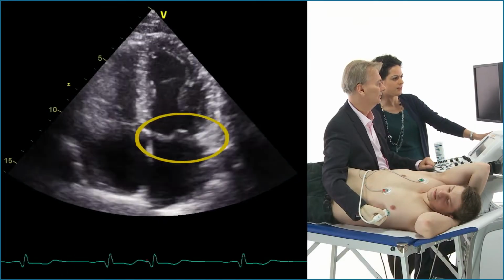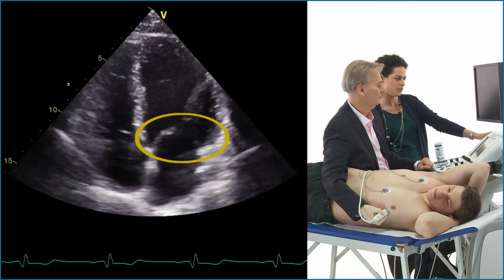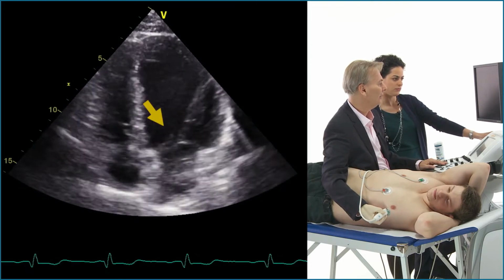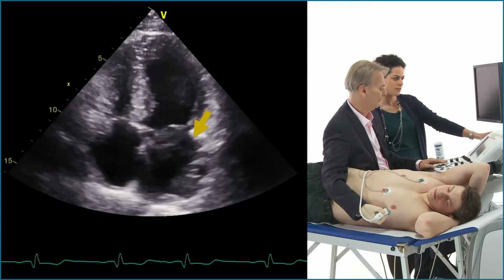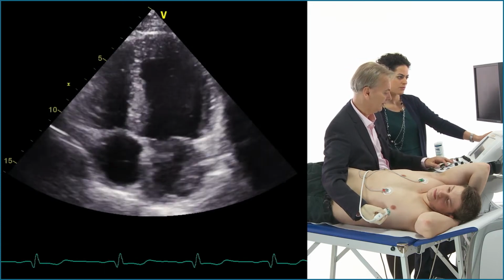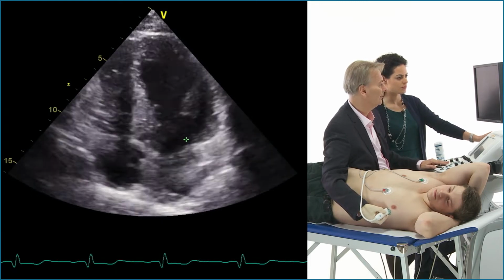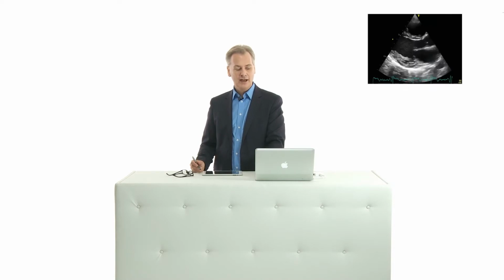Again, the mitral valve on the left. Yes, you see the anterior leaflet, which is a bit longer, and the posterior, which is a little bit shorter. Let me show you this. Here, this is the anterior leaflet. This is the posterior leaflet. Compare this parasternal long axis view with this one right here of our patient. Do you see the difference?